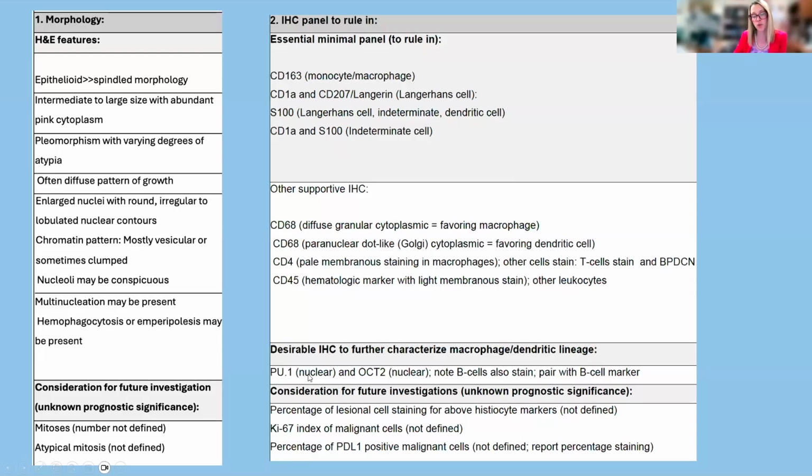It's one of the only nuclear stains, or nuclear markers, of histiocytes. It's a nice marker to really know that those large malignant cells are positive, as compared to cases that have a high intermixed population of reactive histiocytes, where the PU.1 will rather be highlighting the small intermixed nuclei, with negativity in those large malignant cells that are non-histiocytic.